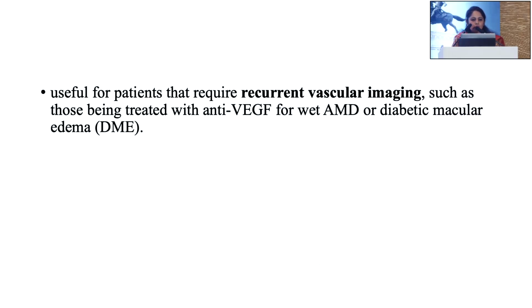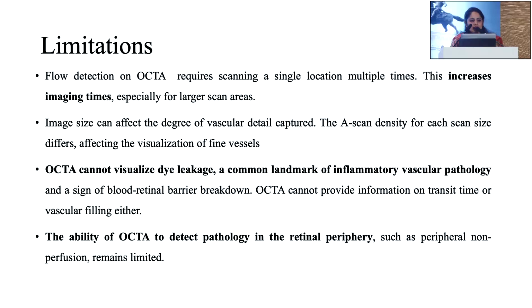So we've discussed all these points, and it is useful in patients who have a contraindication to the dye, patients with chronic kidney disease or any other relative or absolute contraindication to the dye. And because it is non-invasive, we can do it again and again. We can do it in cases which require recurrent vascular images, such as patients being treated with anti-VEGF therapy for AMD or DME.